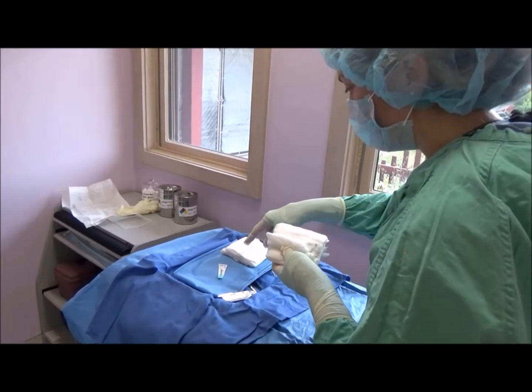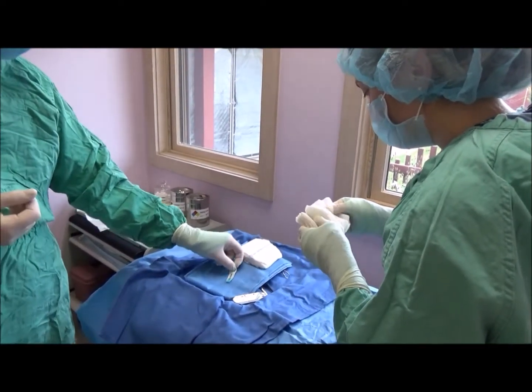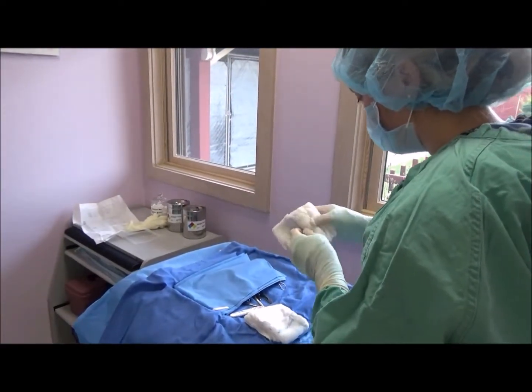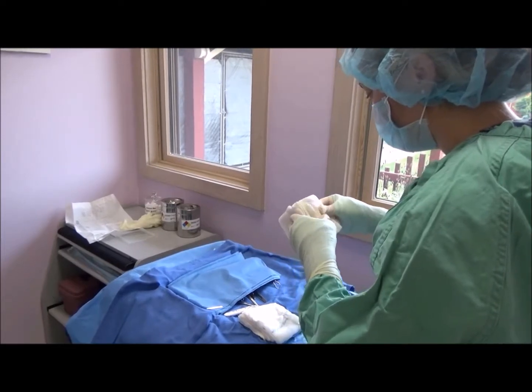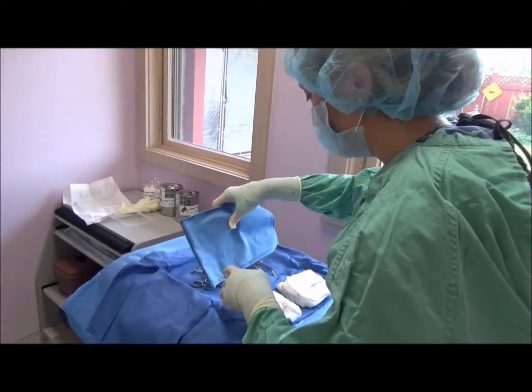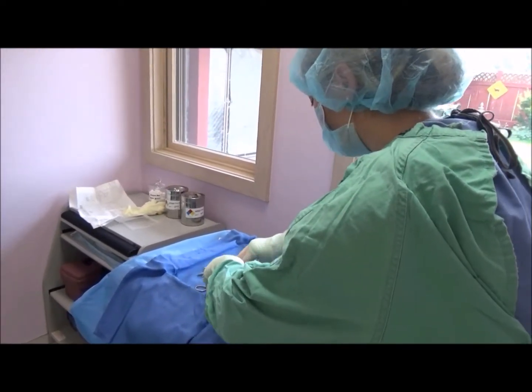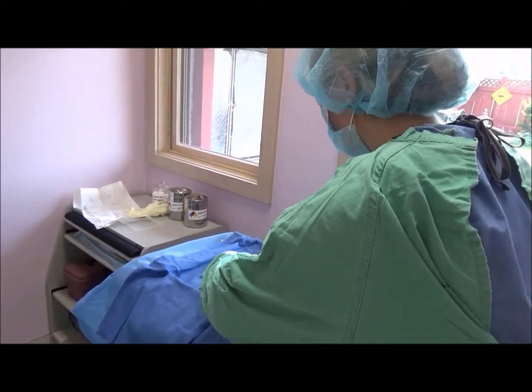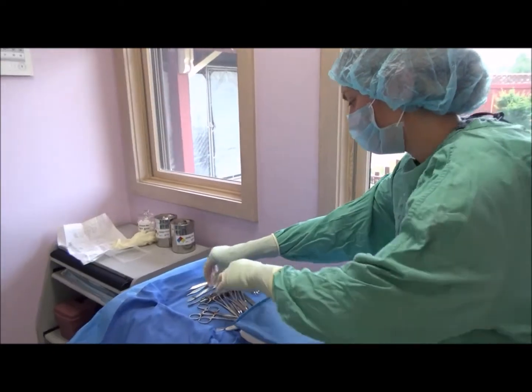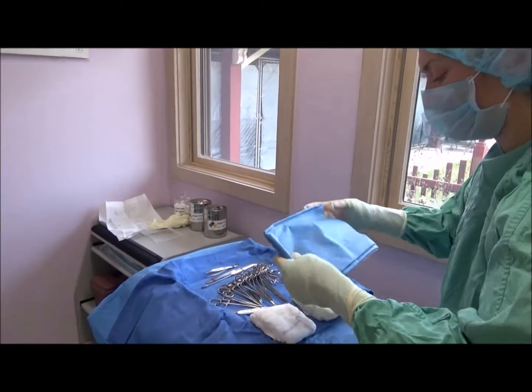And I see that we have our sterilizer strip and it's acceptable, so that's good. 20 sponges, that's good. Okay, so that's good. So there's 18 tools, 20 sponges.